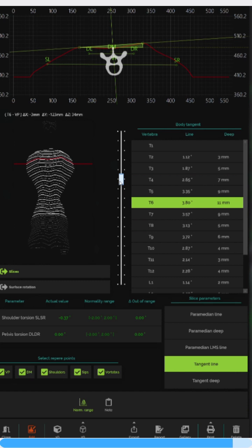So the scan has been very informative as to helping the patient understand there's a bigger problem than perhaps ever been picked up before medically. And whilst this is on the milder end of the scale, it doesn't necessarily correlate with the severity of her symptoms. And this patient was very engaged in their care because they fully understood why they were doing these exercises beyond just pain relief.